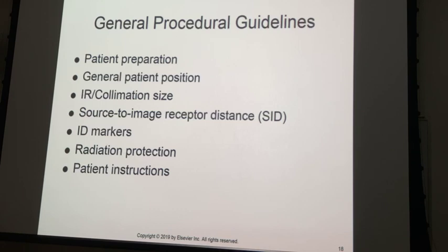Patient instructions for the most part are, depending on the exam, you can actually do a breathing technique with ribs, but it's got to be very limited. And what I mean by that is, most people are just going to shoot on inhalation. I'll shoot while the patient's exhaling. So it's maybe a half-second exposure as opposed to like a 3-second exposure you would normally get out of a breathing technique. By a patient taking a big deep breath, slowly blowing it out, and while they're blowing it out, make an exposure. And that just provides enough motion in the lung markings to minimally blur them out without blurring the ribs. Some of our other exams, we're actually going to use full breathing techniques for the sternum.